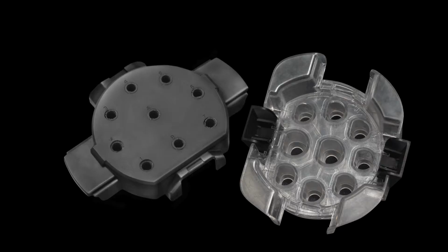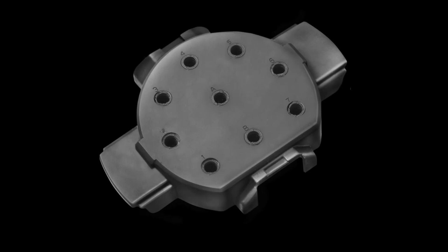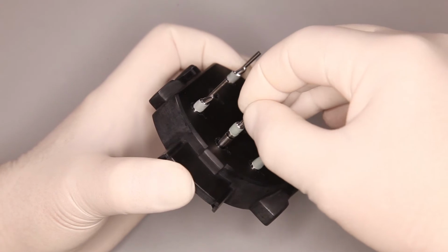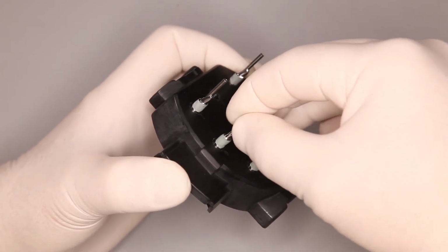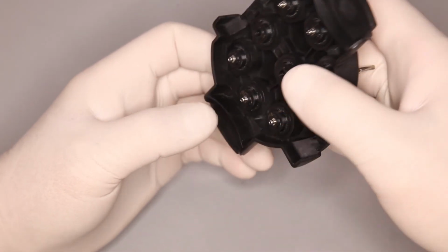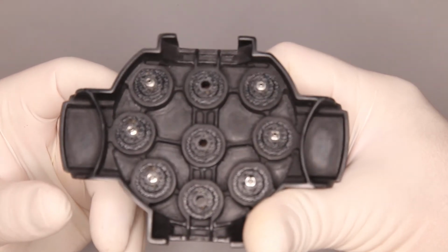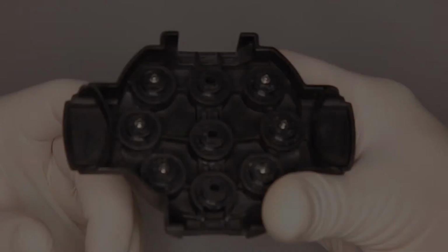To duplicate, we have developed a special box. The box consists of two parts, upper and lower. The lower part of the box contains sockets through which analogs with the ready attached abutments are inserted. At the bottom of the lower part there are outlet holes through which spherical ledges on the apexes of the analog appear.